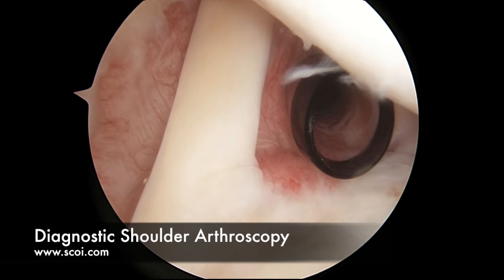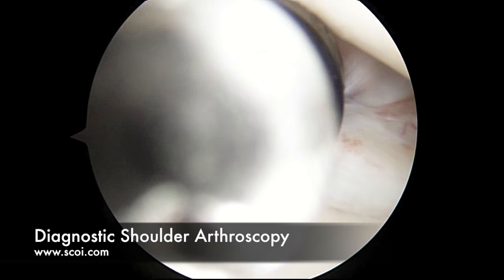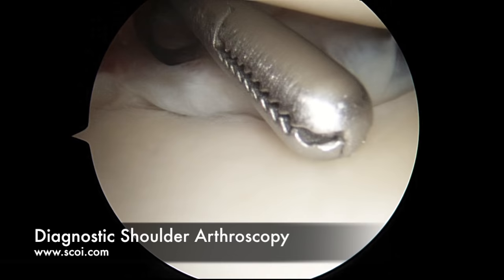So this is Dr. Burge. We're just getting started inside a shoulder arthroscopy. We're going to take a full diagnostic arthroscopy of the shoulder. The patient's on their side. The ball is the ball and socket — the humeral head is up above, the glenoid or the socket is down below.